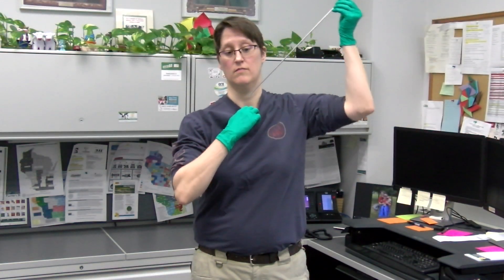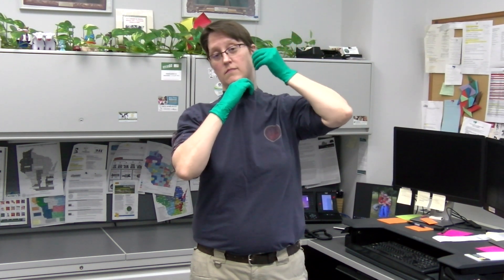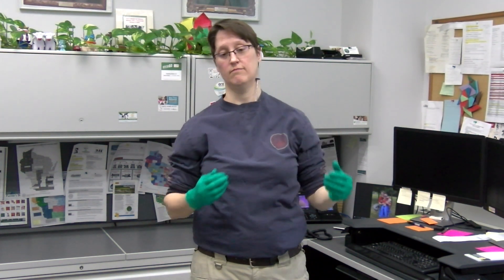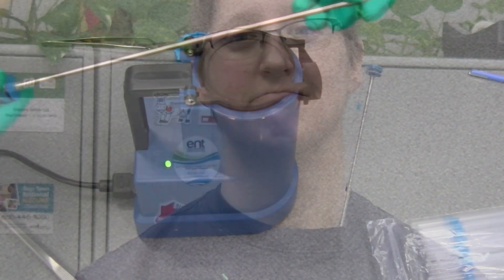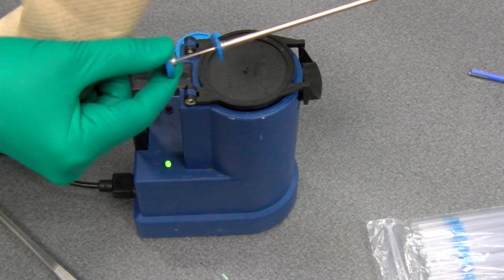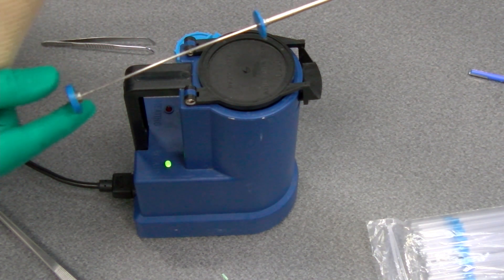AI guns must be warmed before semen straws are inserted to ensure sperm survivability. To warm the gun, place it inside your shirt until you are ready to load it. Sheaths can also be tucked into your shirt to keep them warm if it is cold outside. When ready to load an AI gun, pull the plunger back about six inches to allow for the insertion of the straw.